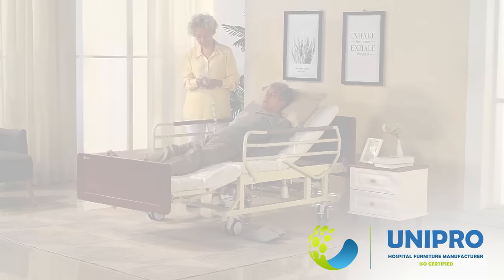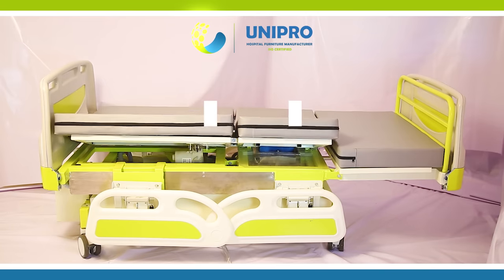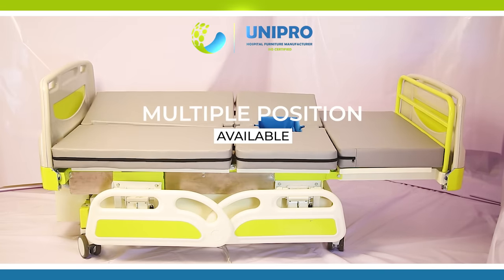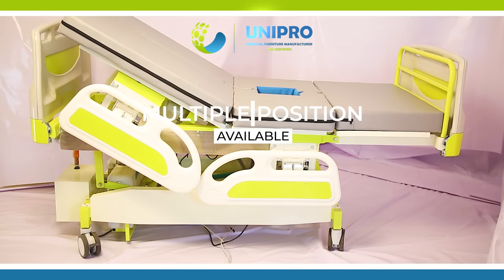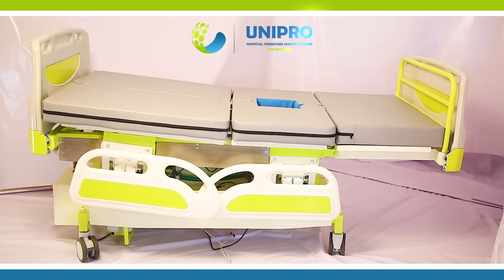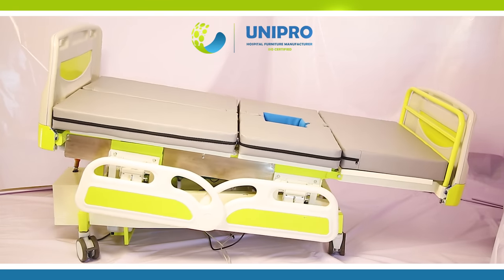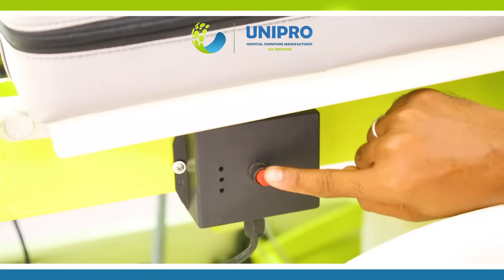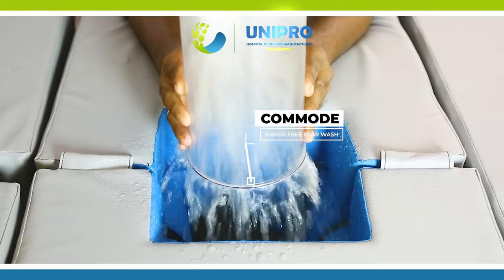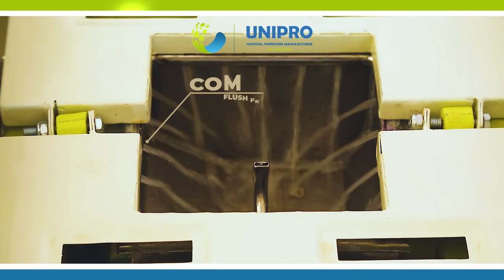Hi, welcome to Unipro Home Easy. Motorized Bed with Commode Hands-Free, Rear Wash and Commode Flush Feature.